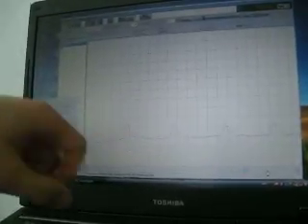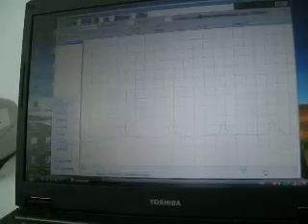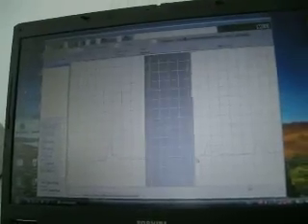So we usually prefer the waveforms to have two clearly distinguishable peaks, first and the second peak. Just to highlight one peak, let's go back to the suprasystolic reading. To highlight one wave, you can do it this way.